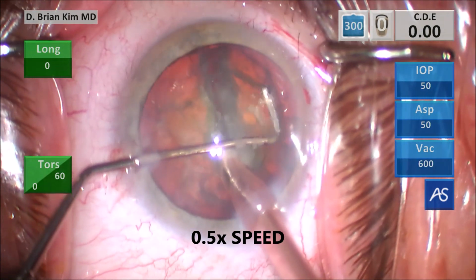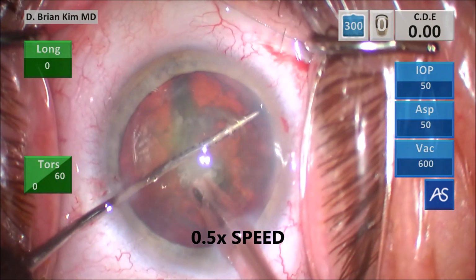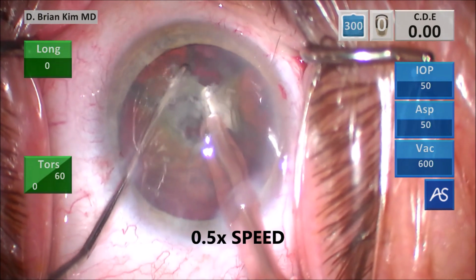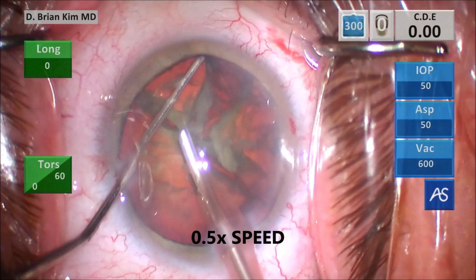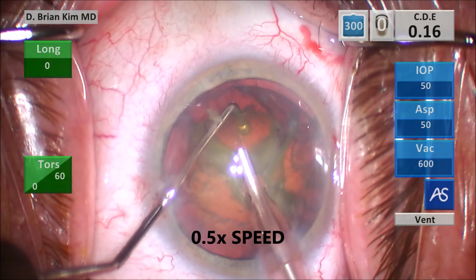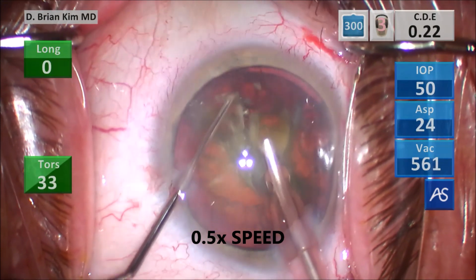Pronating my hand and getting it underneath the right heminucleus, turning the chopper vertically once again, pulling it centrally toward the phaco tip, feeling the resistance as I'm compressing the lens between the instruments and then fracturing that right heminucleus. Lifting that first quadrant up with some vacuum, and then again crushing the lens between the instruments over and over again, and then emulsifying the lens piece.